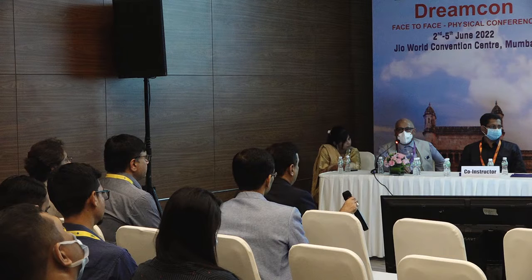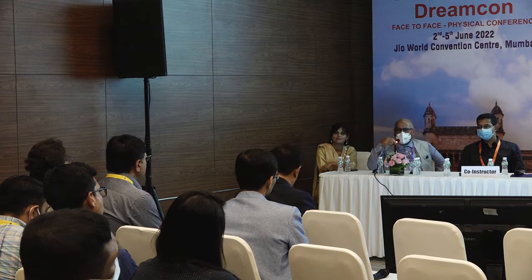But I feel the future generation of doctors will be tending to use Kane and EVO formula. They'll be using the current generation formulas. If you speak to the established gurus in IOL power calculations, they say Hoffer Q belongs to an older generation, and as Ramesh rightly mentioned, Kane formula, EVO formula, maybe are the formulas to look forward to.